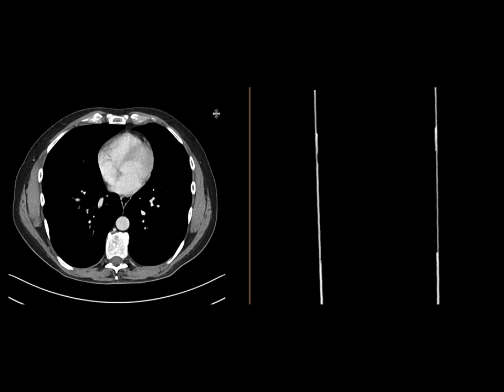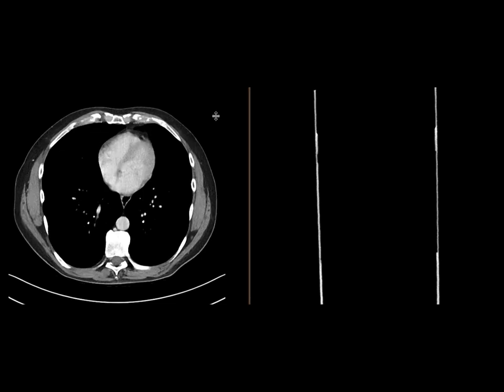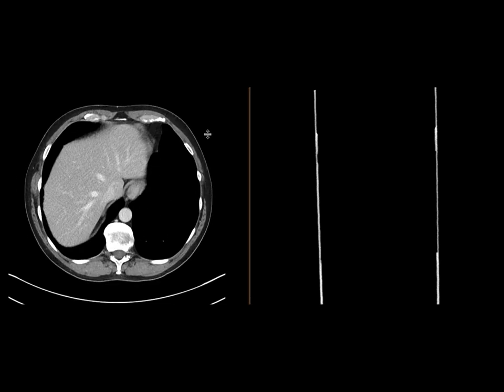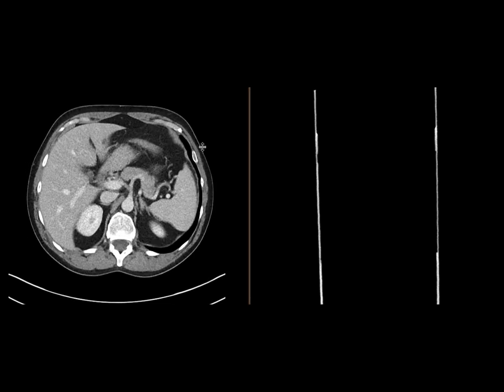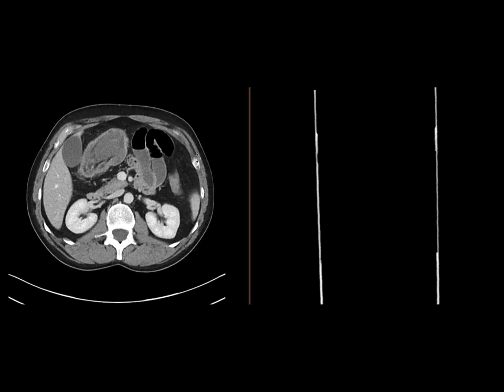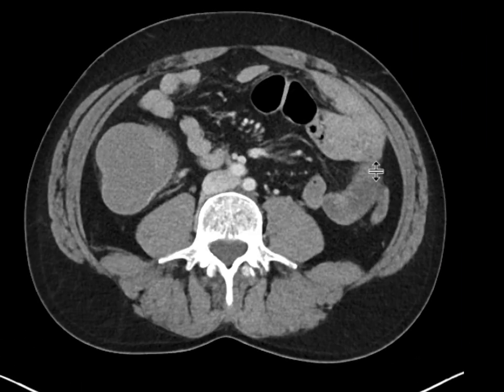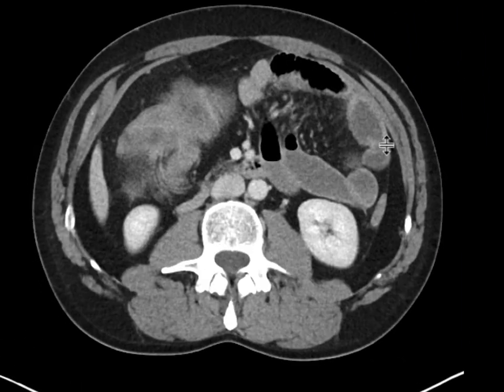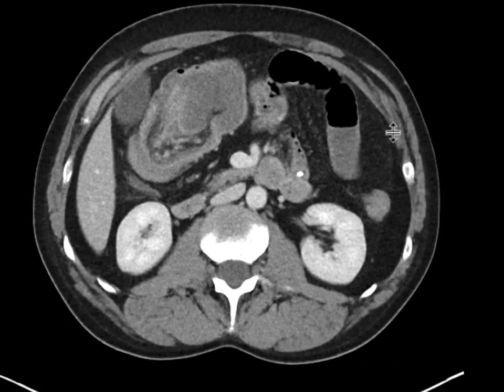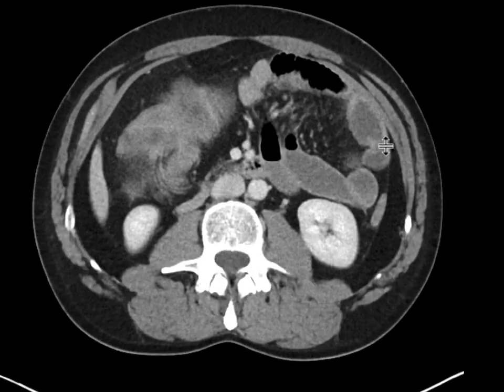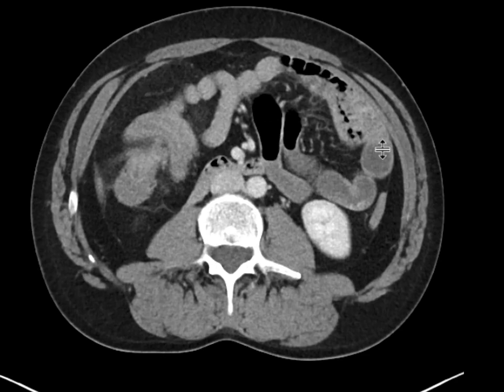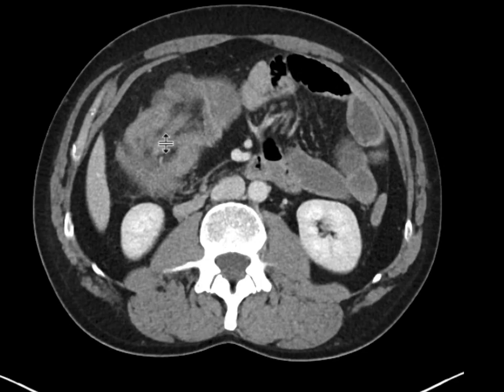We have a patient who came with a history of GI bleed. We've got a CT scan with intravenous contrast, and as we scroll down, we can see that there's a pretty large abnormality involving the large bowel, really at the level of the hepatic flexure and proximal transverse colon.